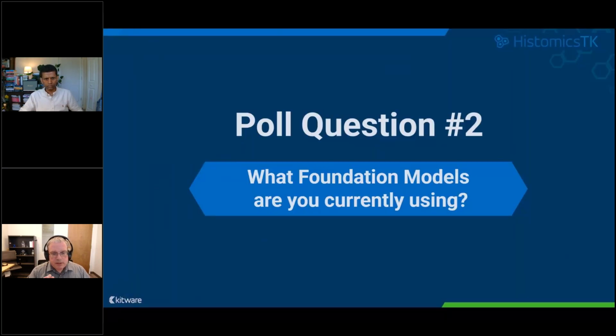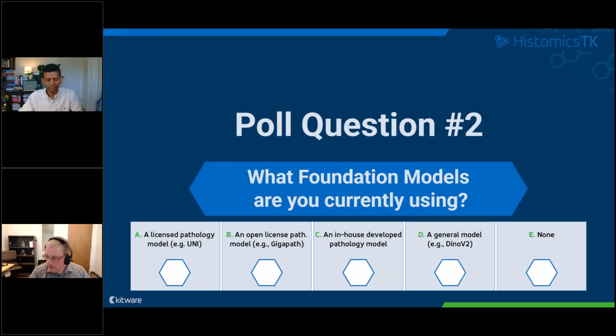And so what foundational models are you currently using is our next question. So if you can launch the poll.